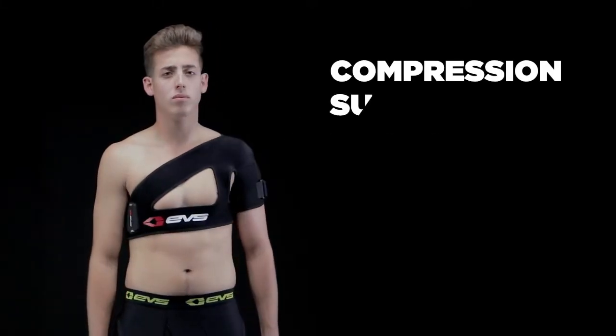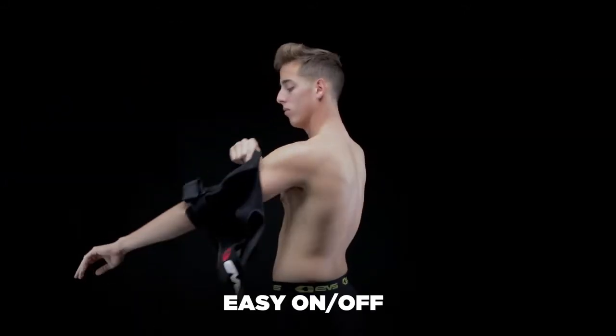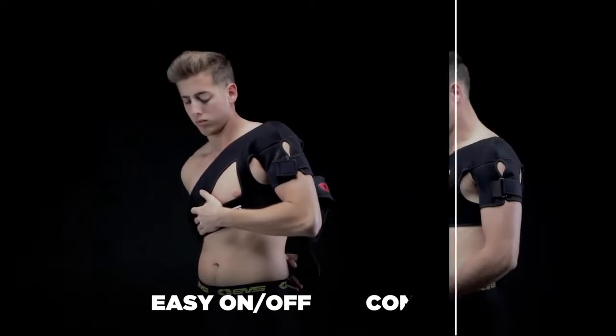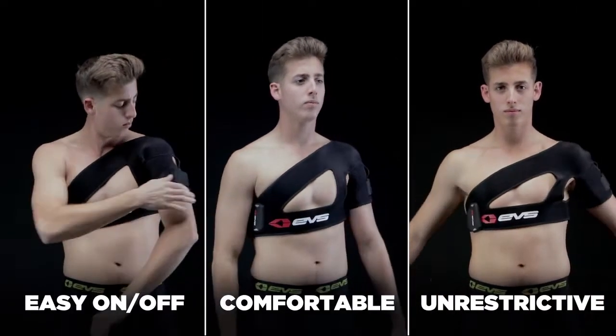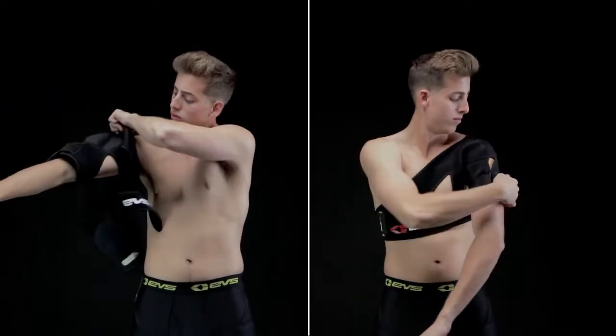The SB-02 shoulder brace provides compression and support and is ideal for a wide range of shoulder injuries. It is easy to take on and off, comfortable, and does not restrict movement during physical activities. The brace is symmetrical and can be worn on either the left or right shoulders.